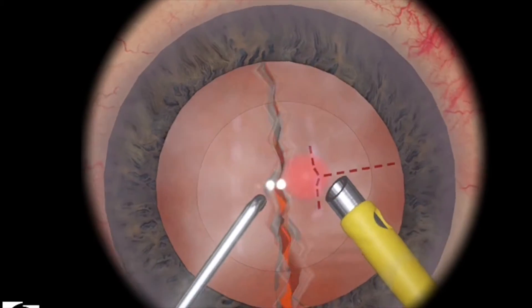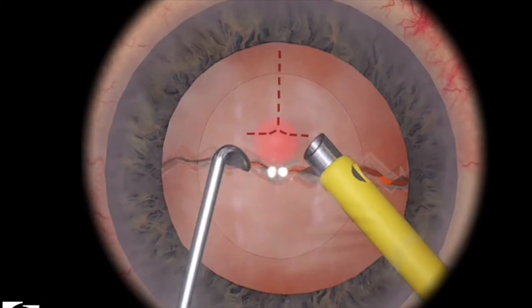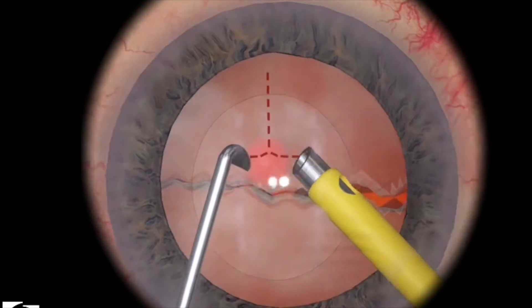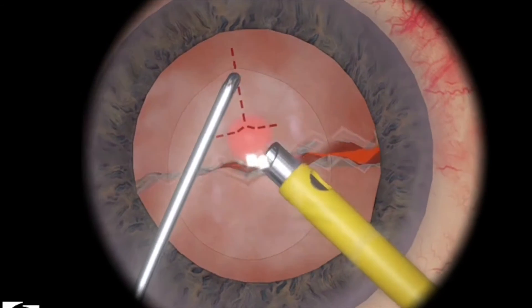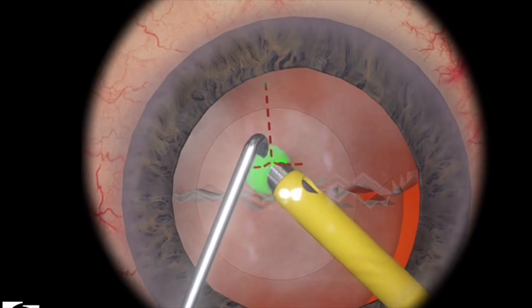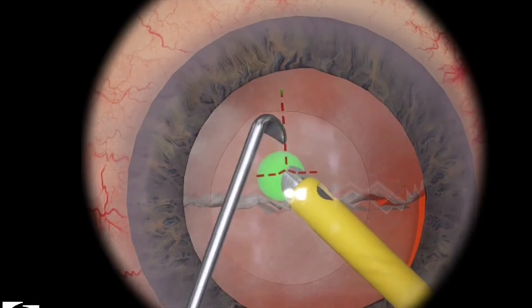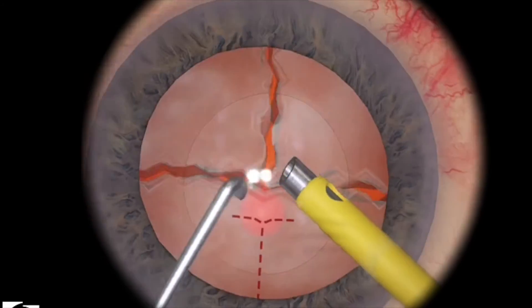I'm able to split the lens directly with a primary chop. And then the same thing with the halves — just bury it deep inside the sphere, use a little bit of ultrasonic energy, and now hold it there with foot position 2. Bring your chopper down, and then crack.